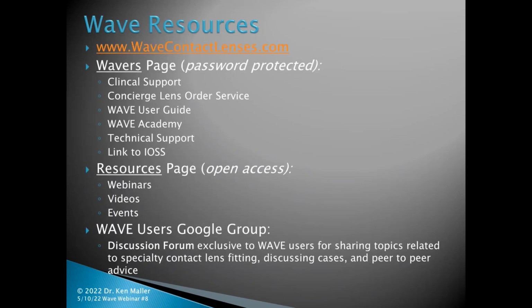Lastly, we have the Wave contactlenses.com page that's from Wave itself, that provides clinical support as well as the concierge lens order services. There's the Wave Academy, where these videos do end up online. It offers technical support, as well as you can get the IOs from there, and the user guide, obviously, to utilize anything that you may not understand how it works in Wave. Then there's the resources page, which really has open access. And then the Wave users group, Google group, where we all will get on and discuss various topics.